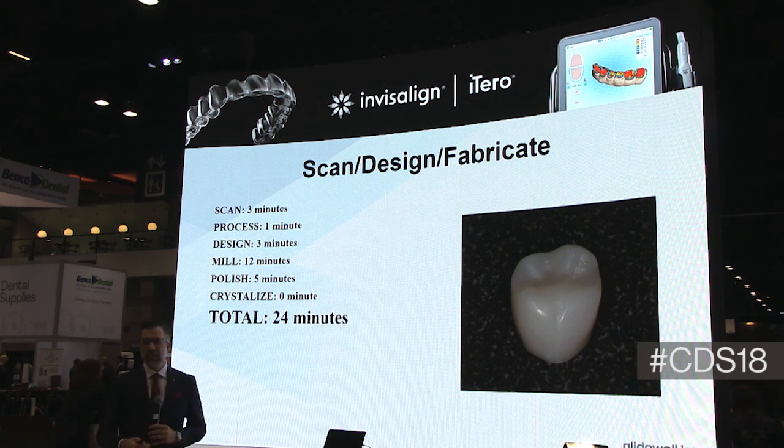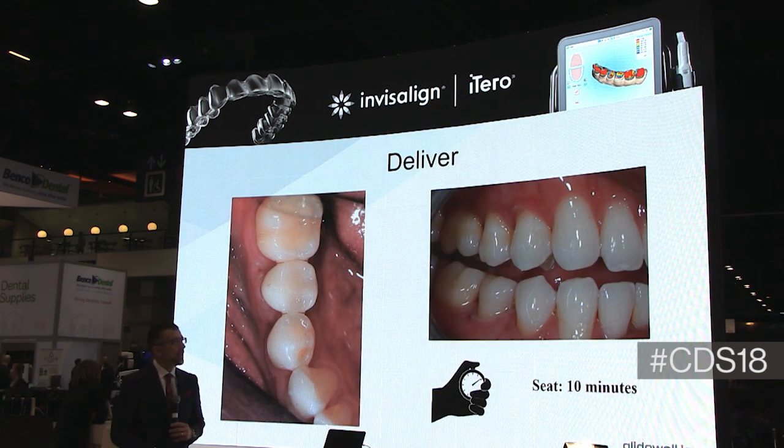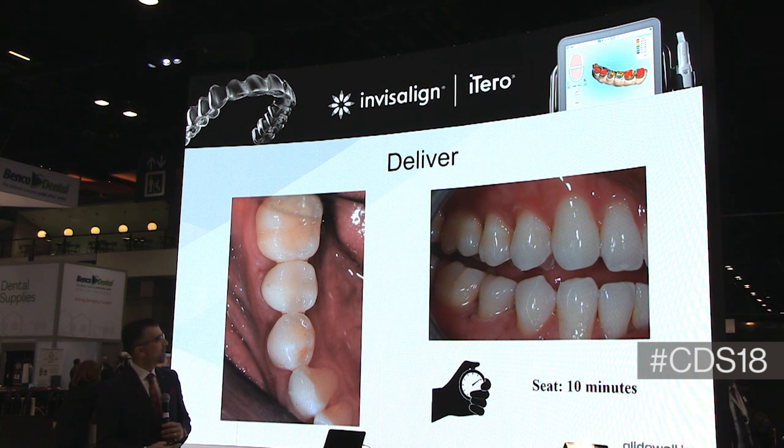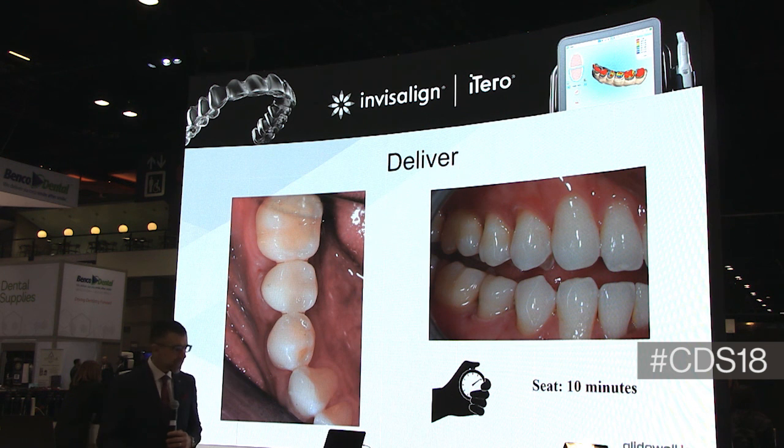You place it in the patient's mouth, and I feel very comfortable polishing it in the patient's mouth. So you'll look at this, it's unpolished, it doesn't look that great. However, when we brought it to the patient's mouth, we were able to polish it, blend it in a little bit better, and it's a very nice alternative.